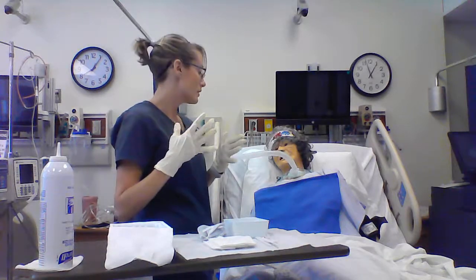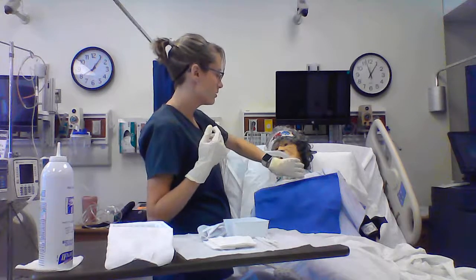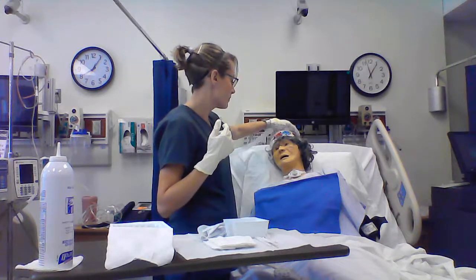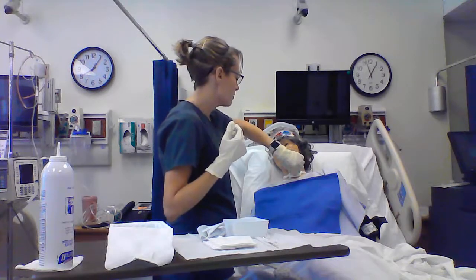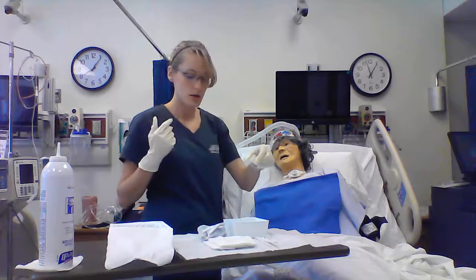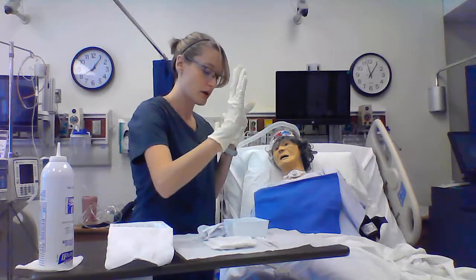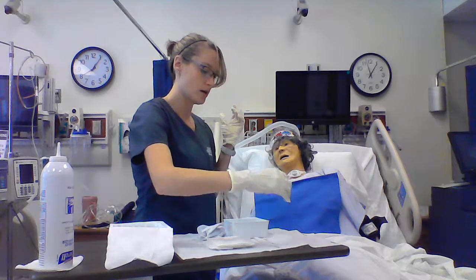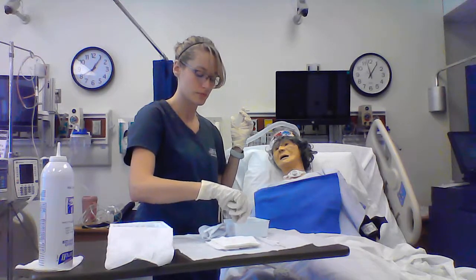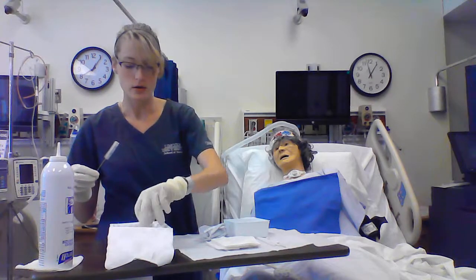So once I'm ready to get started, I'm going to go ahead and contaminate my non-dominant hand again. I'm going to take her oxygen mask off. Unclip her cannula, and set it in my hydrogen peroxide to soak. Using my sterile hand, I'm going to grab my brush and soak it in normal saline so that I can clean her cannula.